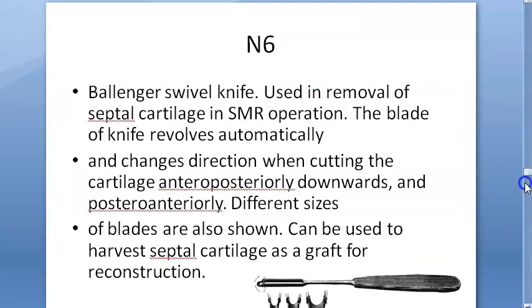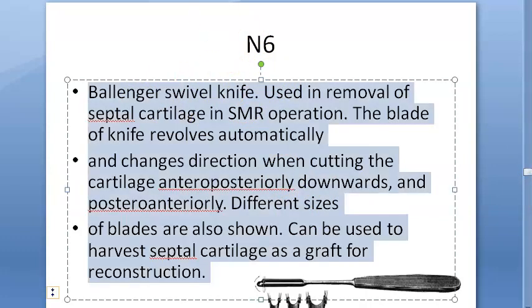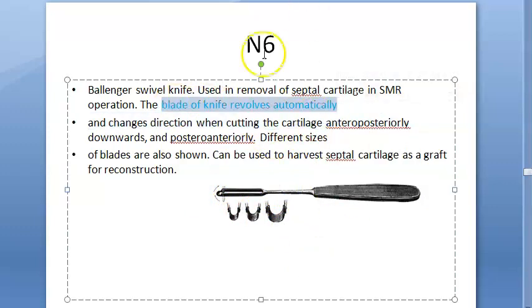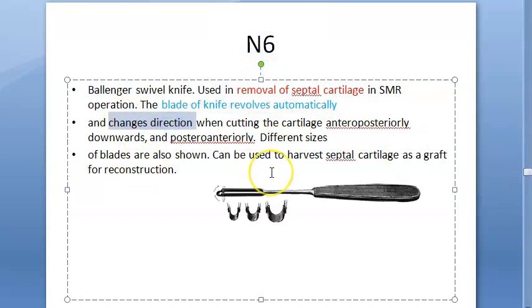Coming to the Ballenger swivel knife — look at this. It has a blade that revolves automatically and changes direction, so whenever you want to cut a different part it changes direction. Nice, right? You use it to remove the septal cartilage in SMR. It changes direction when cutting the cartilage — anteroposteriorly, downwards, and posteroanteriorly. It also comes in different blade sizes.